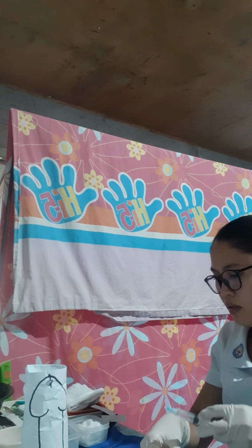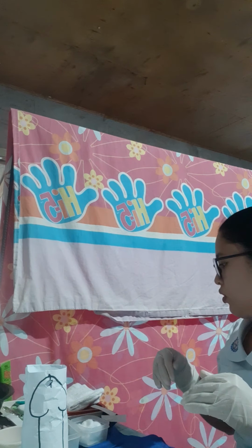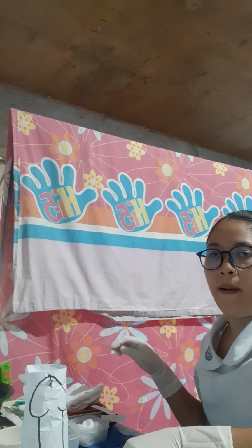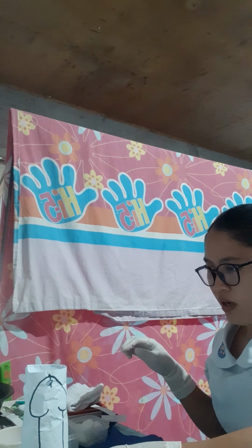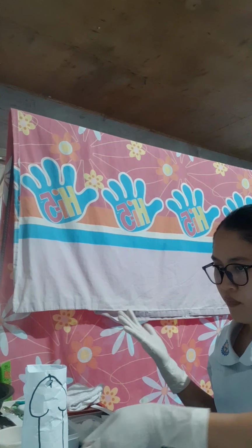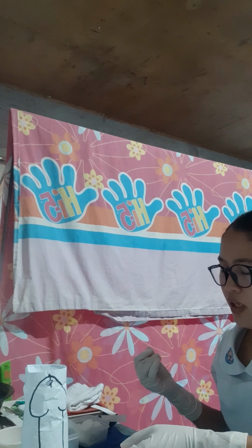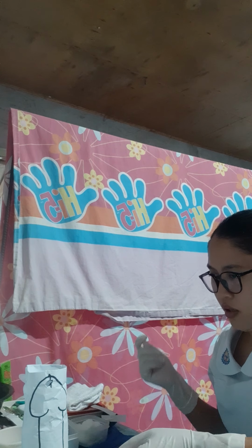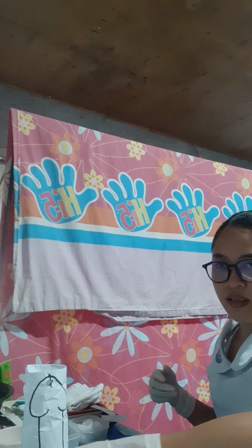The next, we're going to apply the sterile drape to the client just over the thighs of the client, below the penis.